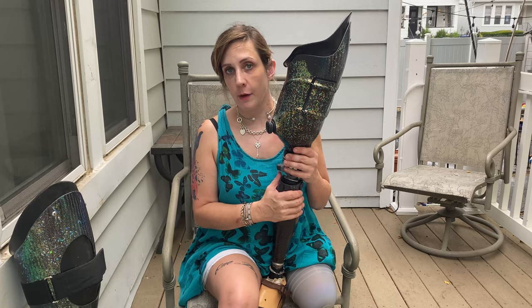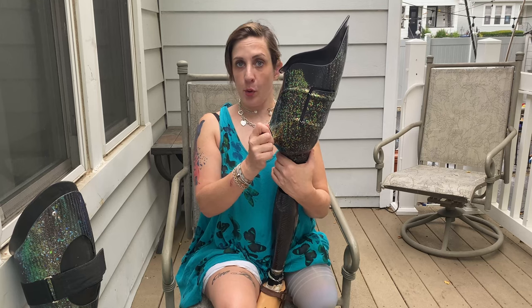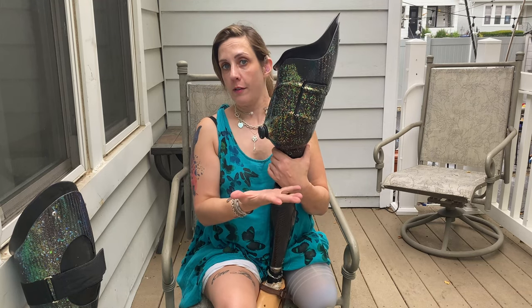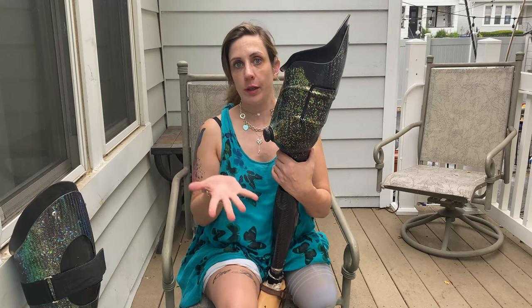Let me show you what this looks like from inside the socket. Your prosthetist is able to design a BOA socket with any number of panels wherever he or she wants — there could be panels here, here, at the back. It doesn't really matter.